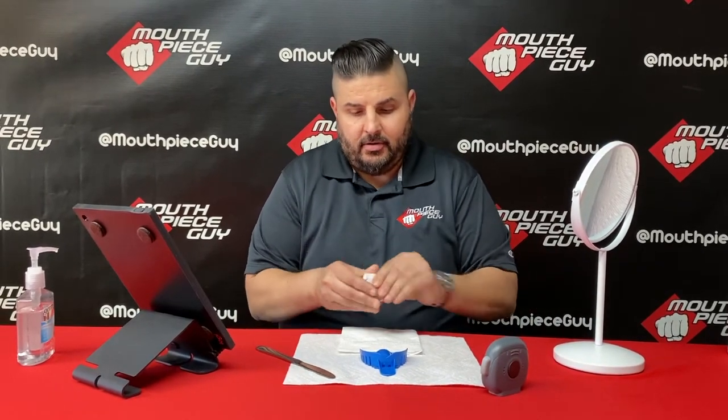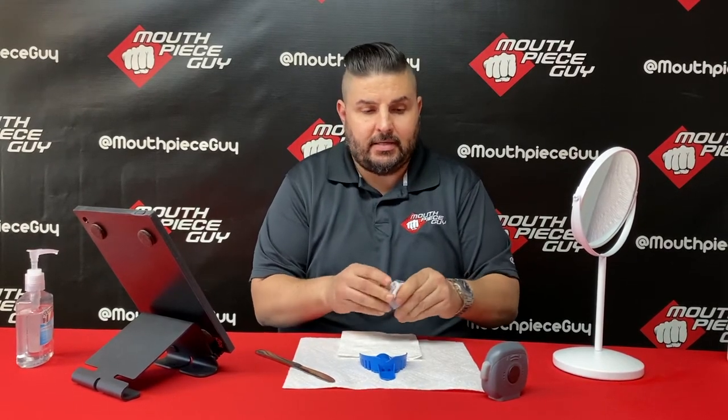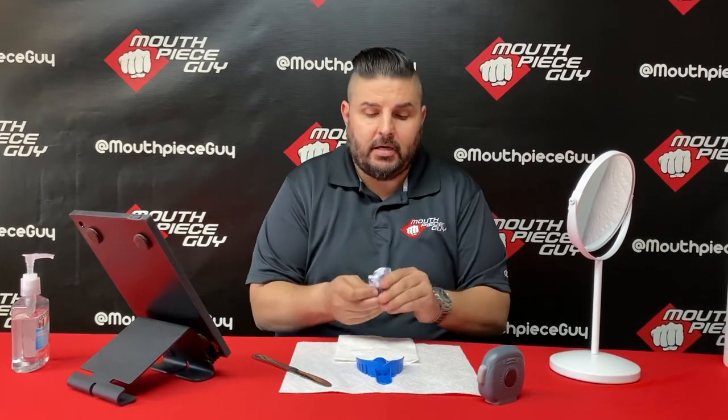We're going to start mixing our putty and hit the timer. You always want to start the timer at zero and then count up. You don't want to set a timer for five minutes and 30 seconds and count down — it's always zero and then up.